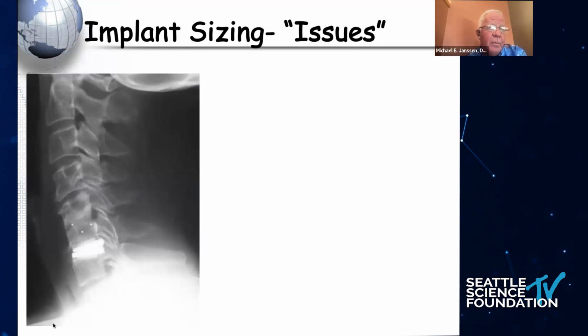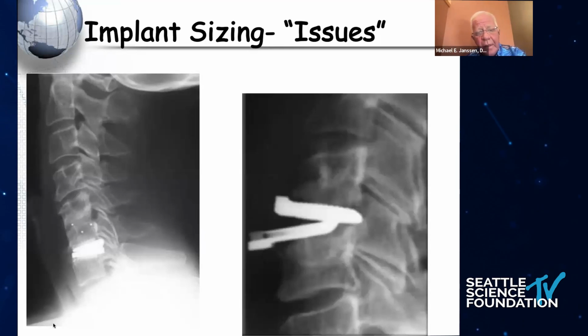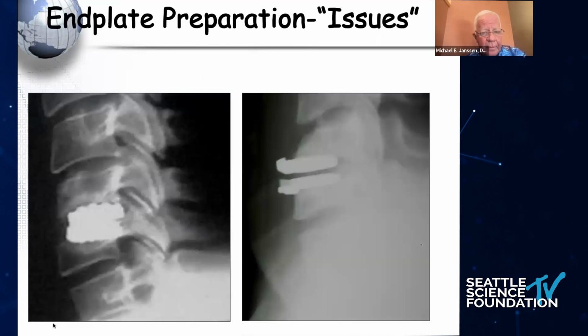But we've also seen, when we first started training lots of surgeons in the last decade and a half, implants like this put in less than ideal position. There's a fusion up above. You can see the implant looks like it's into the canal. The axis of rotation wasn't matched very well. And here's another mismatch, a clear-cut mismatch of a press-fit prosthesis. It looks like the inferior or superior plate of the bone may have been milled a little bit, maybe not opened up enough, and clearly the mechanics of this implant are going to be problematic for reconstruction.